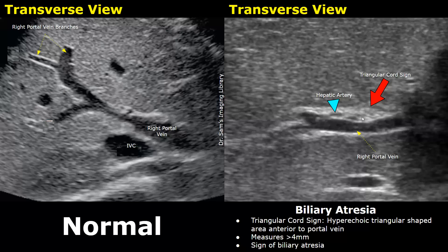This is how the triangular cord sign looks: there is a thickened triangular-shaped hyperechoic area anterior to the right portal vein. You can see a hyperechoic prominent area at this location. This area usually measures greater than four millimeters and is a sign of biliary atresia.